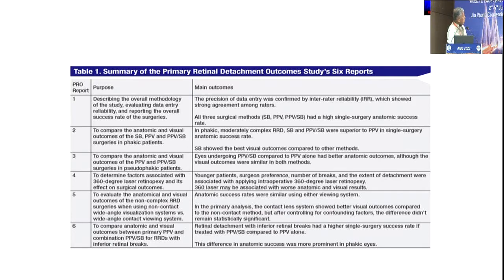The next one was to evaluate the anatomic and visual outcomes of non-complex rhegmatogenous retinal detachment when using non-contact versus contact systems. And again, anatomic success rates were similar using either of the systems.